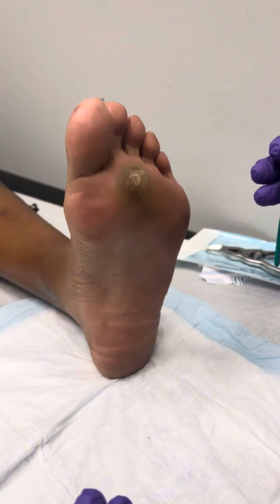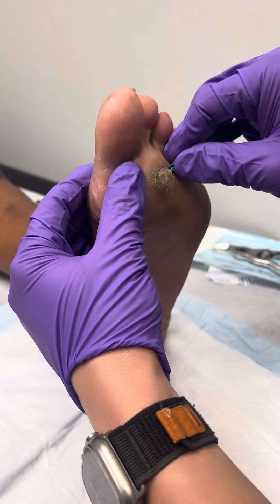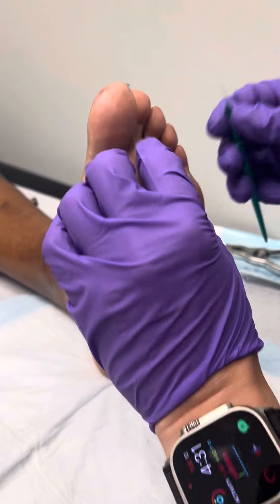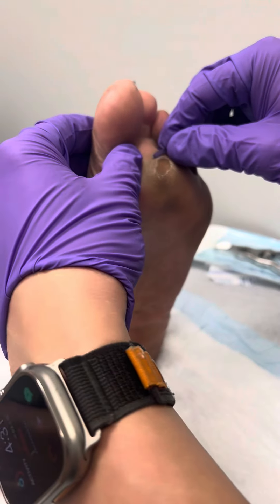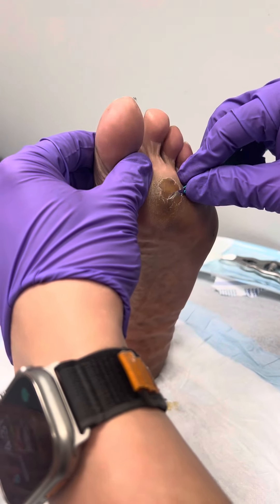I like to use a 15 blade. I know there's been comments about maybe using a 10 blade, which is a bigger blade, but I find that I have more control with a smaller blade. What we do is carefully peel away some of this dead skin.